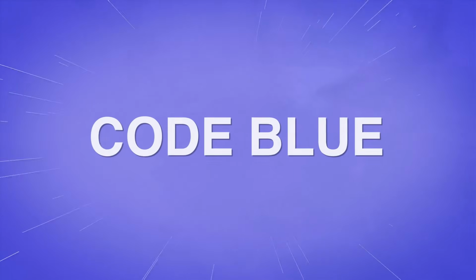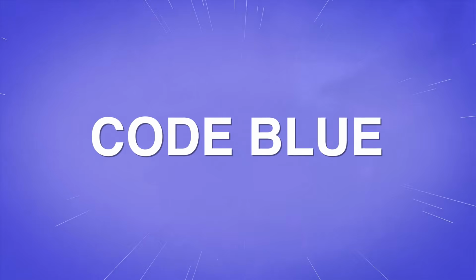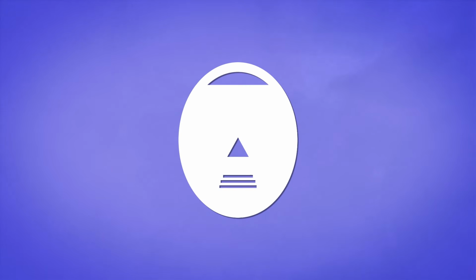The school's cardiac emergency response team should be notified using the established code, for example, code blue, using the team's established communication system. The goal is to complete the AED drill in under 3 minutes, from the person falling unresponsive to the first AED shock.